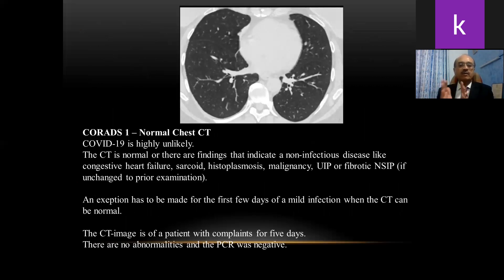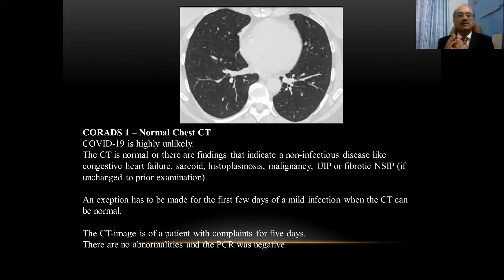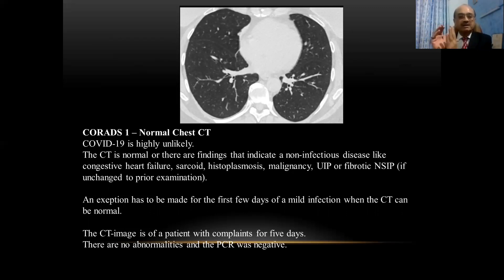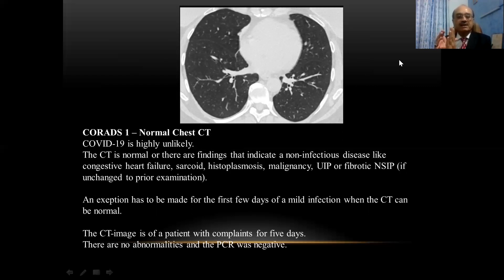CORADS 1 is a practically normal CT scan. Whenever you see a picture like this with CORADS 1 on the CT report, COVID-19 is highly unlikely. The CT scan is normal, or there may be findings other than infection such as congestive heart failure, sarcoidosis, malignancy, or some interstitial lung disease. However, an exception — the pitfall — must be made for the first few days of a mild COVID-19 infection when the CT scan can be normal. This CT image is of a patient with five days of complaints; there are no abnormalities on the CT scan and the PCR was negative, confirming no COVID-19 infection.